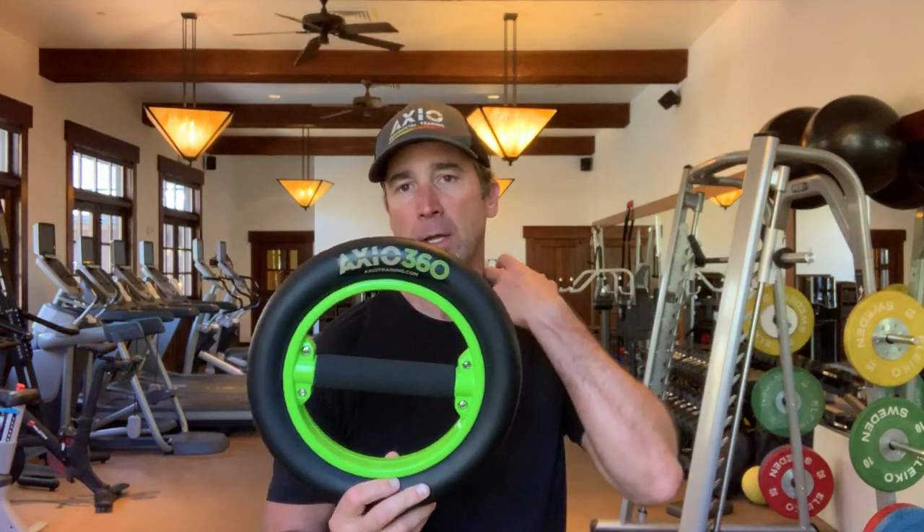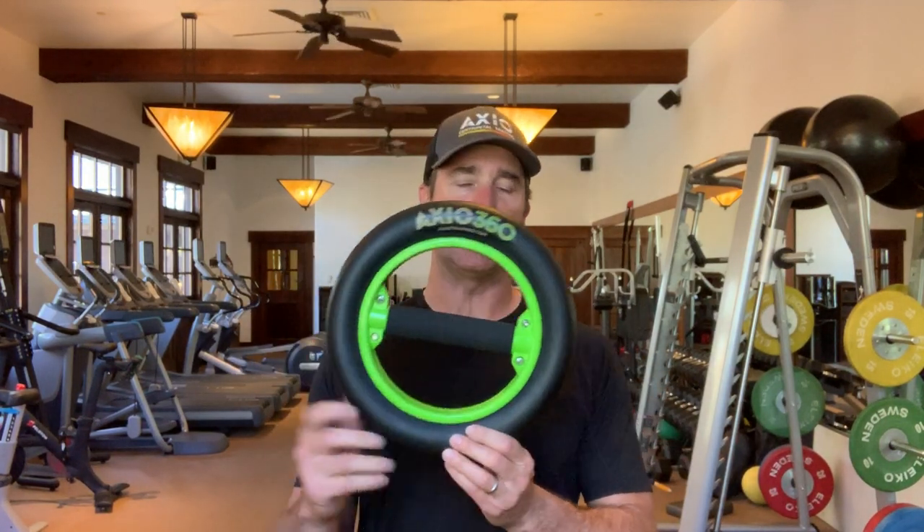Hey guys, this is Ted Besmer, physical therapist and strength coach. I have here the Axio 360 — this is our introductory centripetal trainer. It has a half-pound carbon steel mass and a resisted channel.